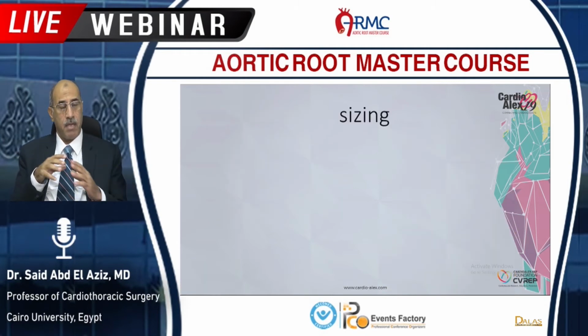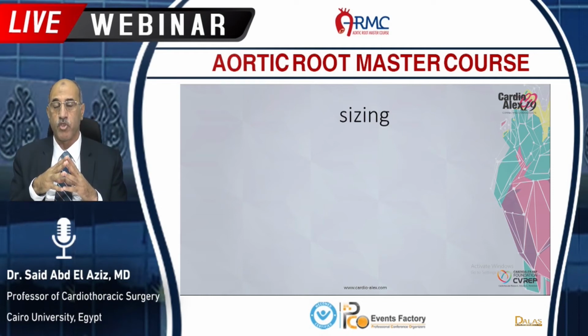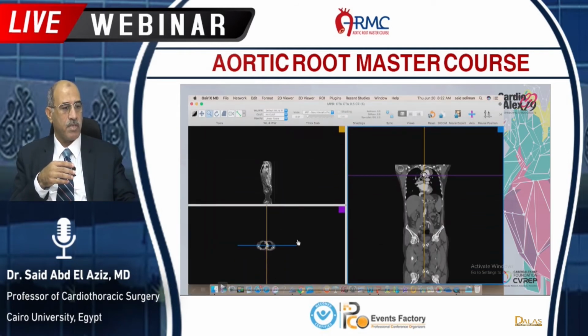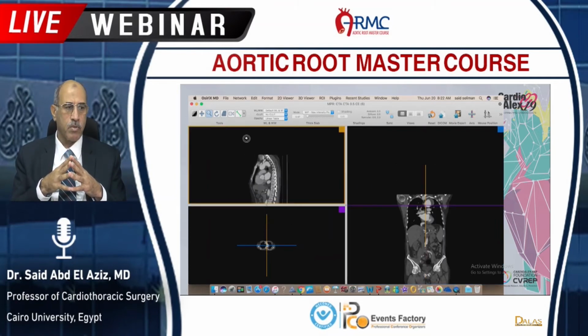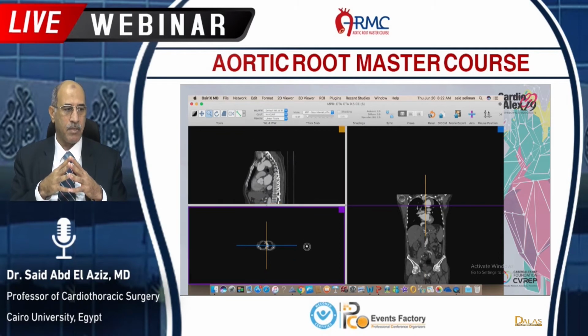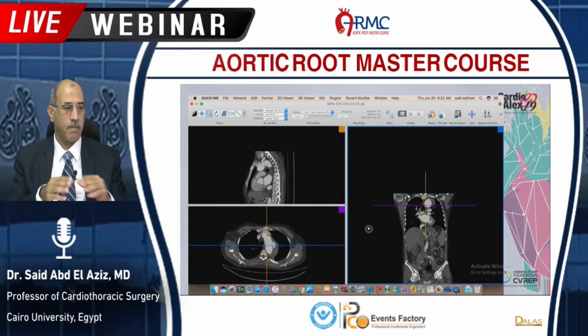What about the sizing? This is very important to choose the type of the stent and to choose the size of the stent. Sizing is very important. Here, this is a short video also to show you how to use your computer to size and choose which stent size.